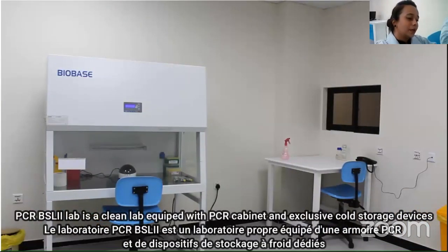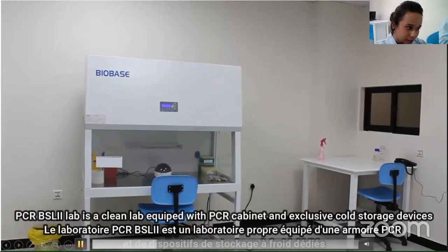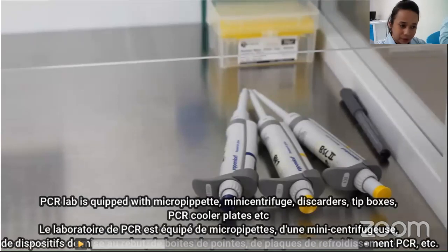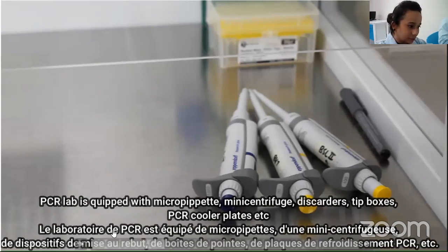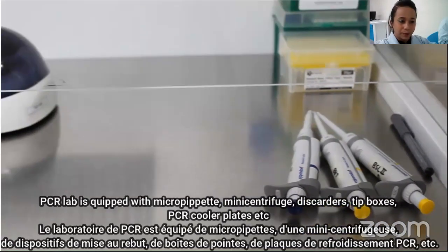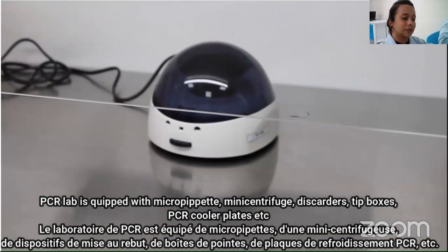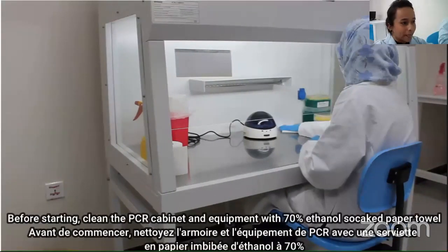It should also be equipped with exclusive cold storage devices dedicated only for storing the kit and related reagents. No samples or RNA should be stored in it. The laboratory should also be equipped with small equipment, including micropipettes and mini centrifuges, and different supplies, including tubes and tips. The tips should be filtered.